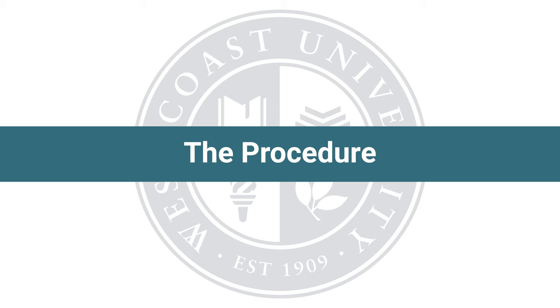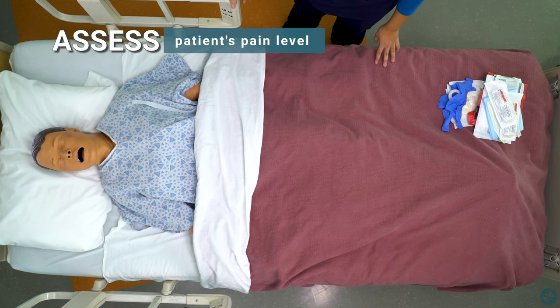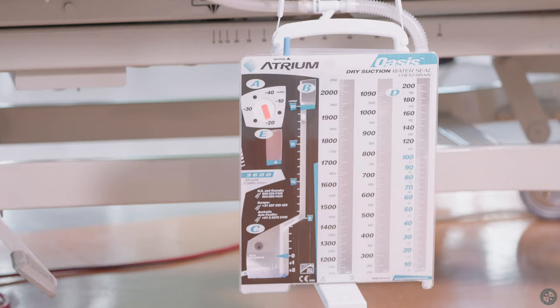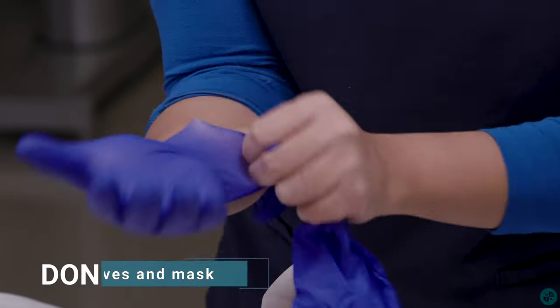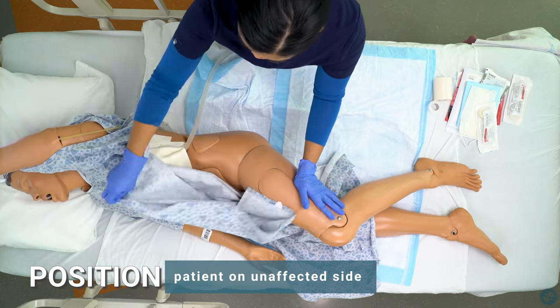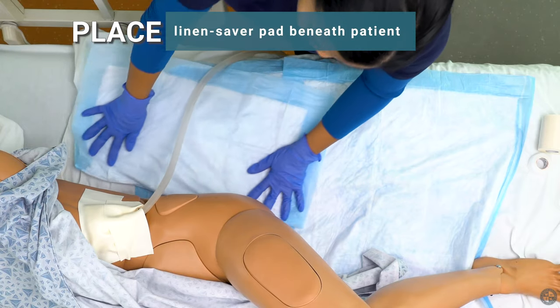The procedure. Assess the patient's pain level. Raise bed height and lower the head of bed. Assess the closed chest drainage system. Don gloves and mask. Position patient on unaffected side. Place linen saver pad beneath patient.